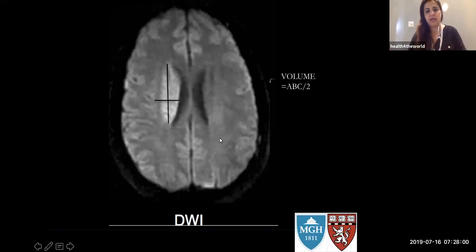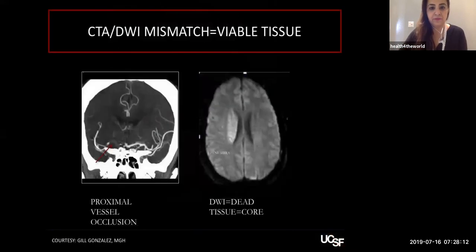So you can actually calculate. We used to do the calculation of the volume on the scanner in Boston when the patients came in and got a DWI. So it's very easy. You just need a calculator, and then you can do it manually too.